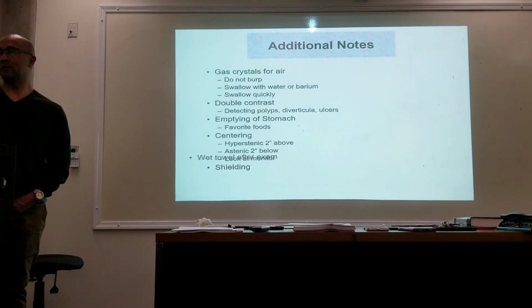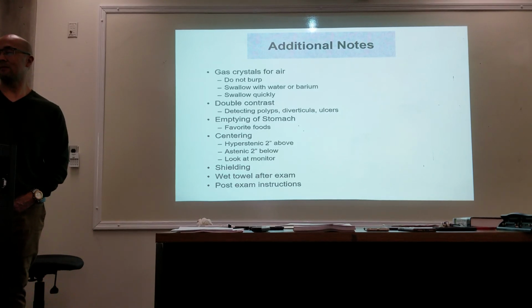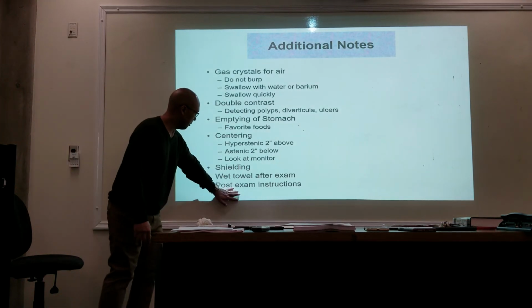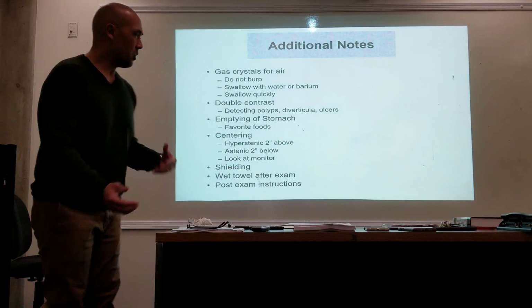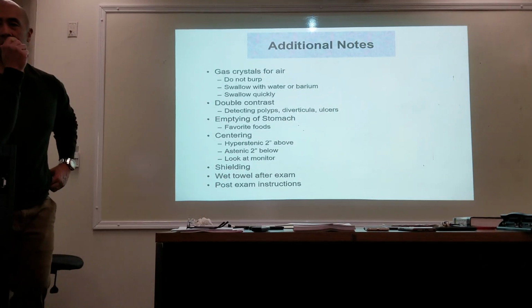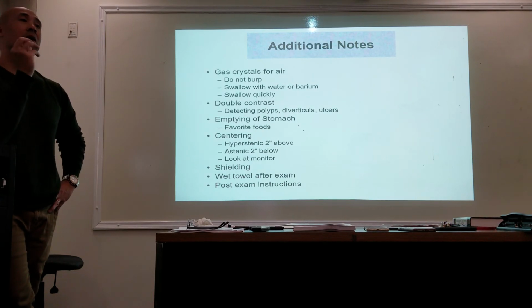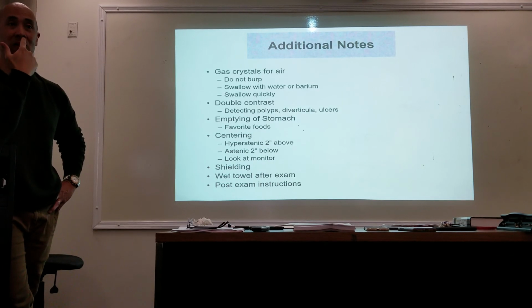We already did this, so you guys can look at this on your own. Okay, so post-exam, so we've already covered this. What I want to talk about now is the post-exam instructions. So after they're done with their procedure, you're going to get them dressed. You're also going to be nice and clean around their mouths. Okay, we don't want them leaving the department with white stuff around their face.